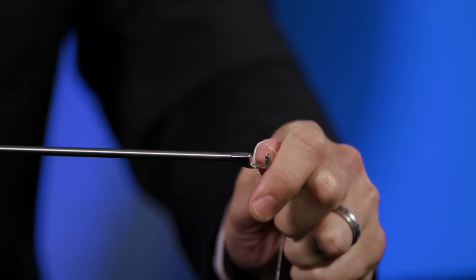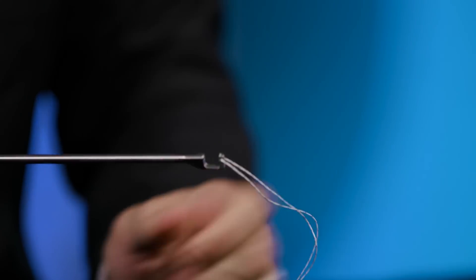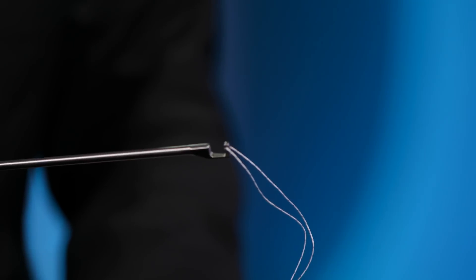To load a suture through the Capsule Closed Scorpion, you'll take your number two fiber wire and load it in the distal jaw notch. To do that, you'll make a loop with the suture and slide it until you feel it click in and engage in that distal jaw. You can slide the suture to control how much you want to have through the lower portion of the device during your passing.